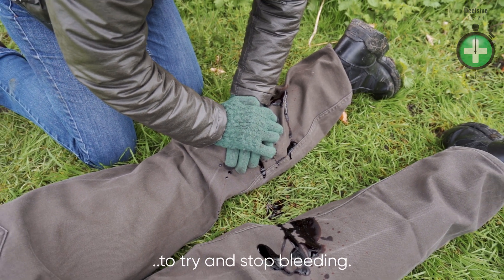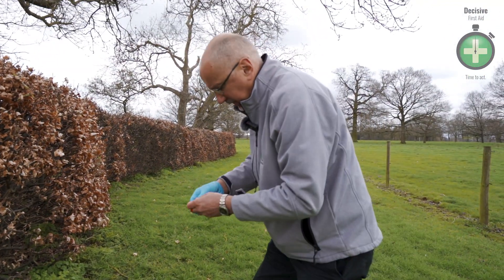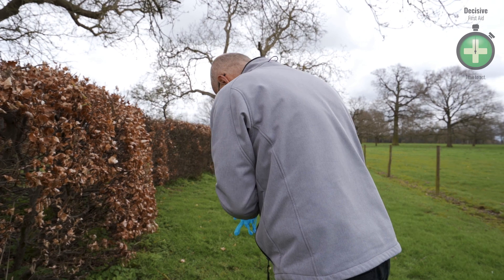Cliff, can you hear us? Cliff's not responding — he's unconscious. Our main control focus now is this catastrophic bleed.